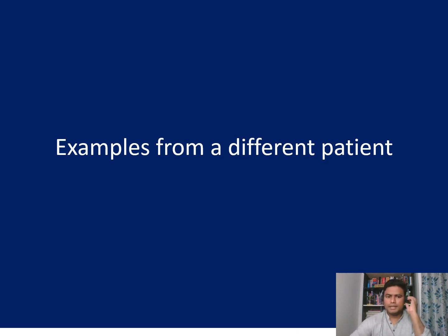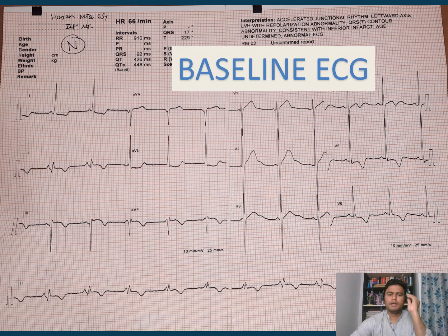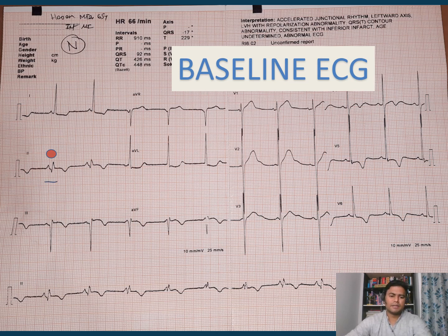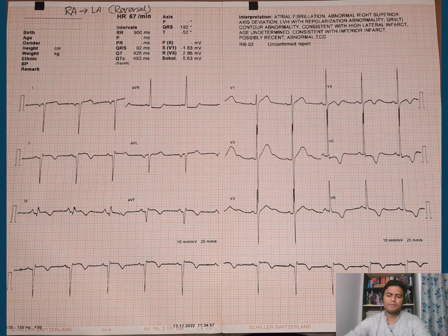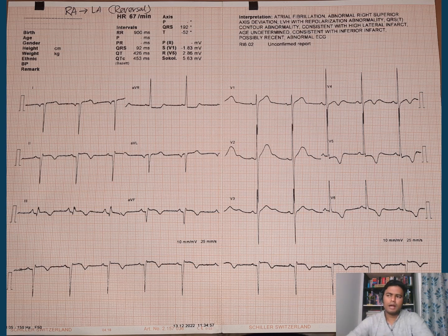Now let's see examples from a different patient. Here is the baseline ECG where lead II has some T inversion and Q waves, lead III has a deep Q wave and T inversion, lead AVF also has T inversion, and lead I shows some ST changes. Lead AVL has some ST depression. V5 has a large Q, large R, and ST-T inversion, same for V6. This previous ECG represents an inferior MI with left ventricular hypertrophy.